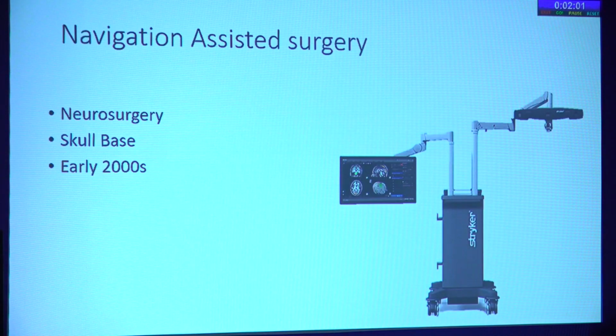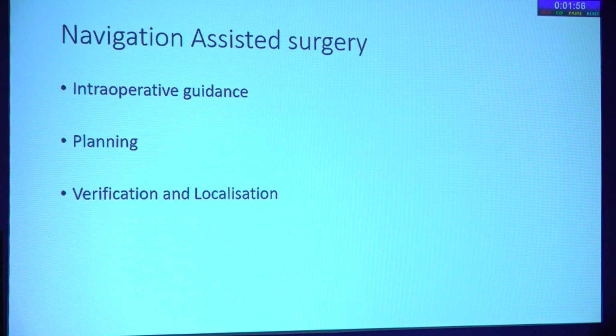So just like a GPS tracker. It was started for neurosurgery, but it has come into orbital fractures because of its intraoperative guidance. It's been used for fractures and also for apical tumors, the tumors which are very close to the nerve. So we will know how close we are to the nerve. That is the biggest advantage of navigation. Without navigation, sometimes we might go very close to the nerve or we might even hit the nerve.